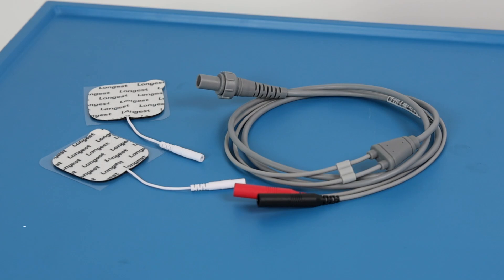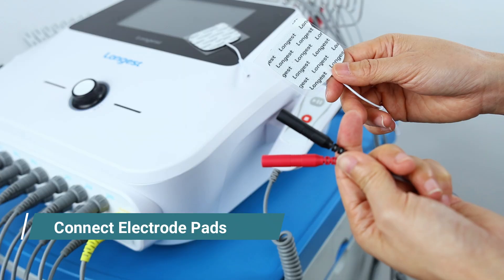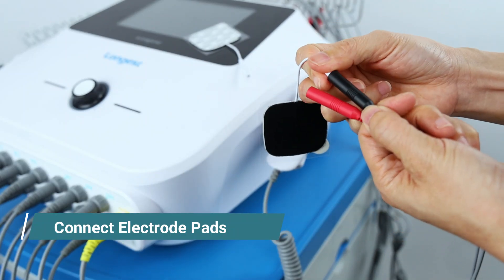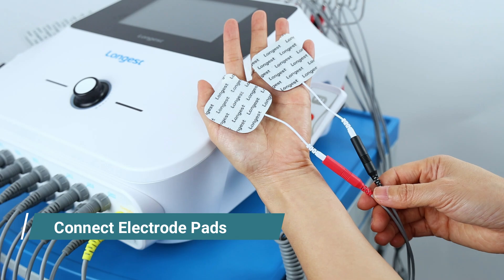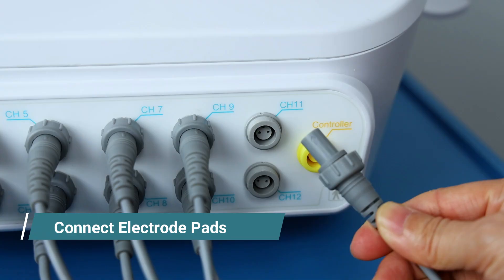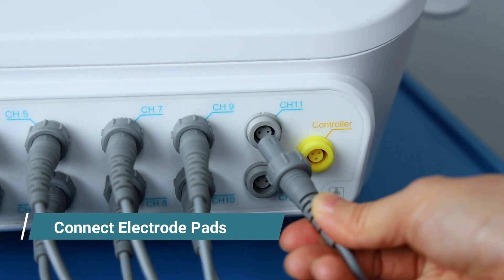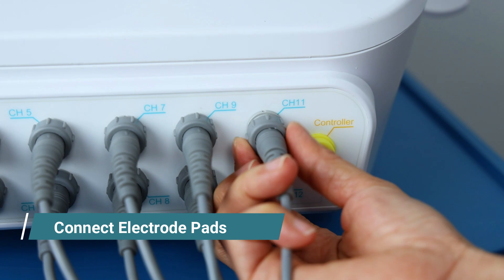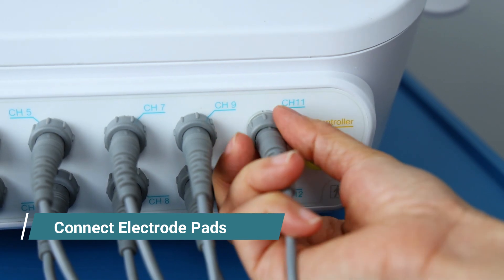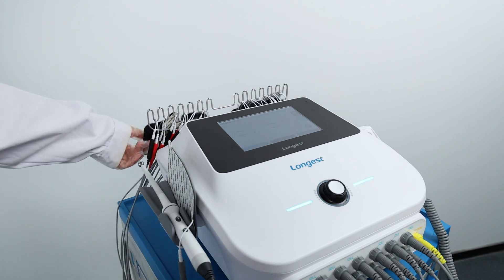First, set up the device. Connect the electrode pads with the lead wires. Then connect to the device. There is an arrow mark on the connector — follow the arrow mark and insert into the socket, then tighten the screw. Place the electrode pads to the rack.